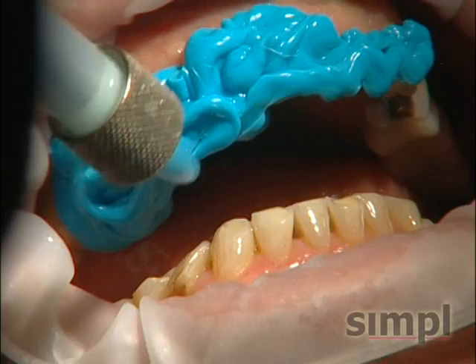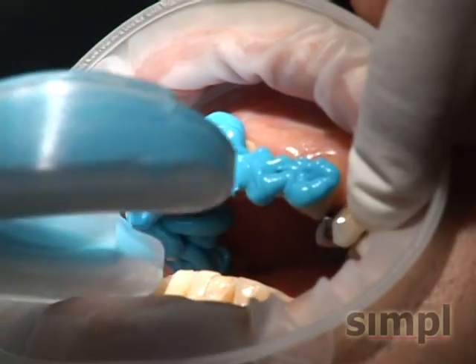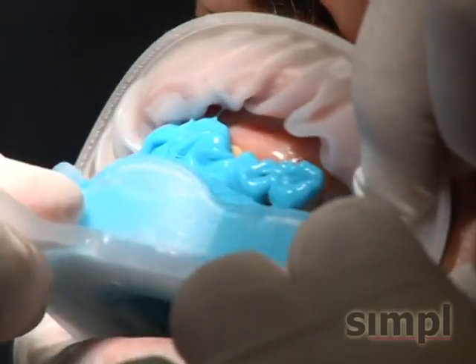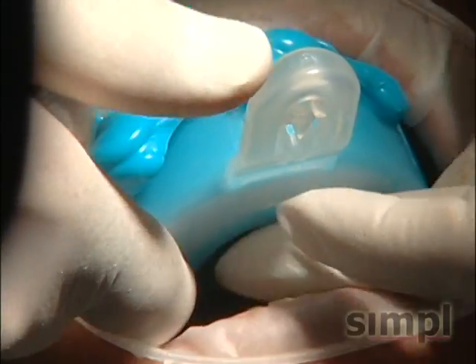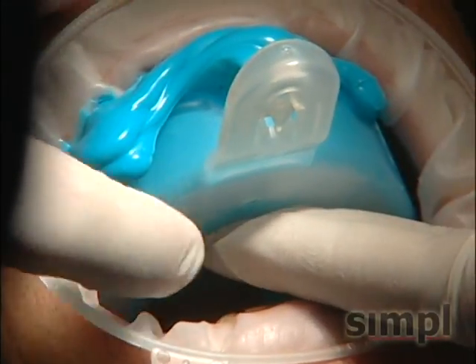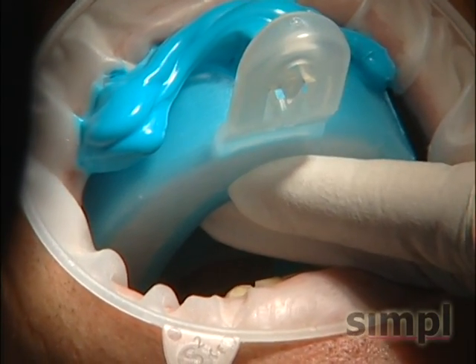Taking our impression there right now. This is a closed impression system. Open. Great. I'm going to let that set for 4 minutes.